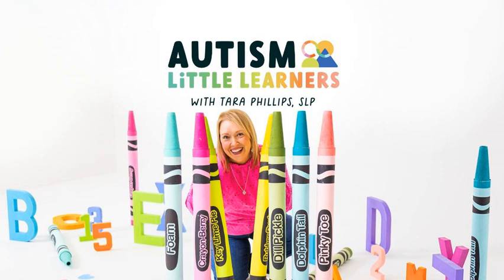For example, upon arrival, you could model hi or happy, good morning. When lining up, you could model go, wait, or next. When cleaning up, model finished, help, or all done. These small repeated interactions help children connect AAC with real-life experiences. For many autistic students, predictable transitions are anchor points throughout the day, and this can be one of them. Embedding AAC during these moments supports both regulation and communication, helping students feel calm, capable, and understood.